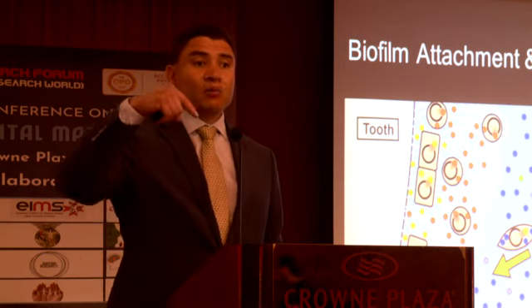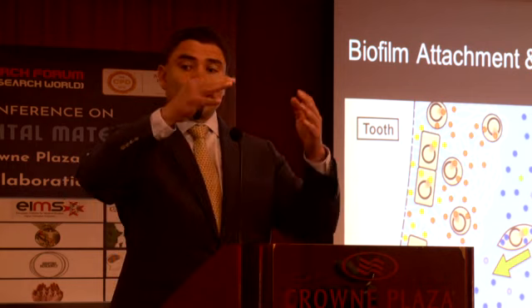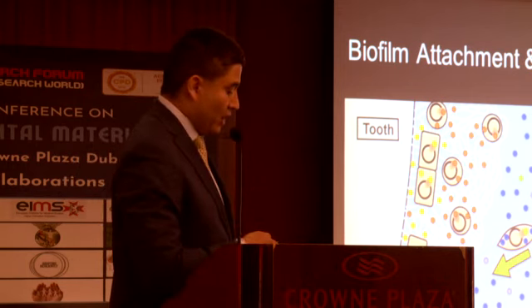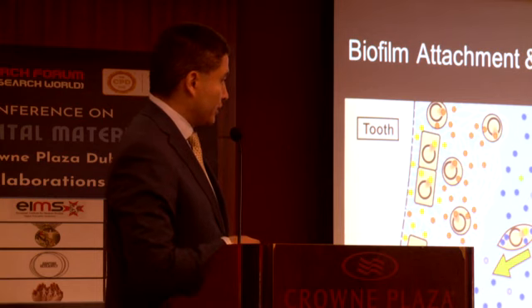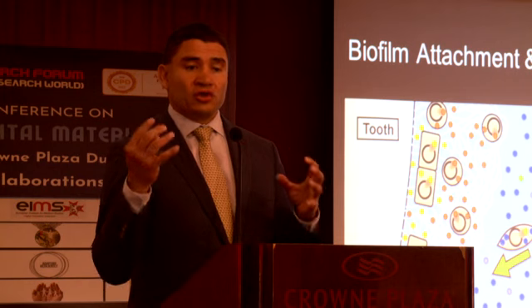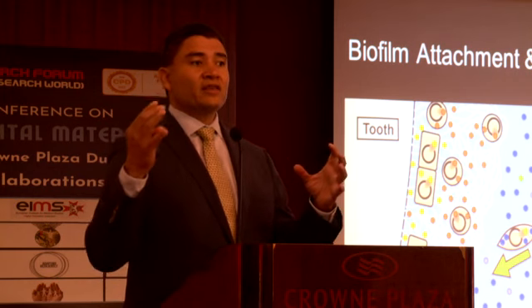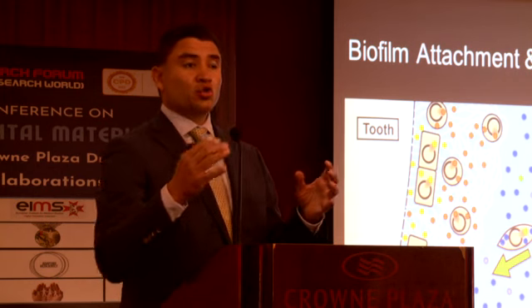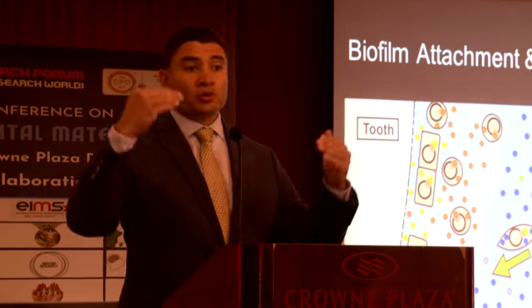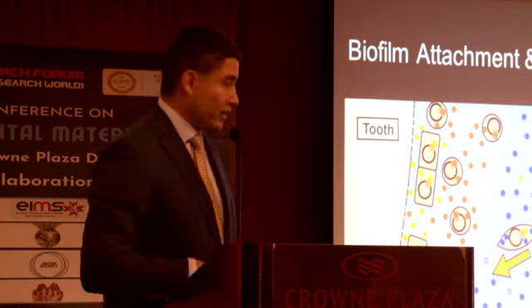We place an implant, we interrupt the connection between the external environment and the internal environment. So if there are other surfaces in the mouth that are colonized by biofilm, like the soft tissues, these colonies will find a new attachment environment on the implant surface that we just placed, because now we interrupted the connection between the outside and the inside, right?